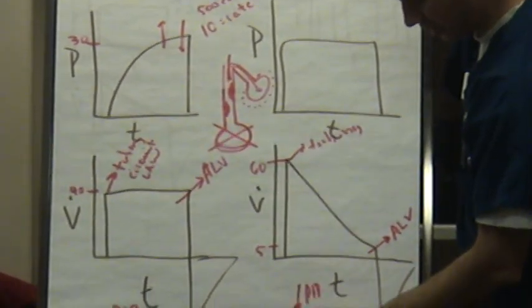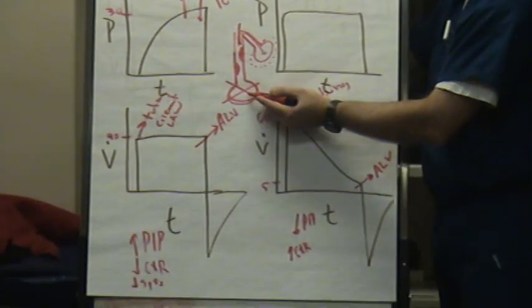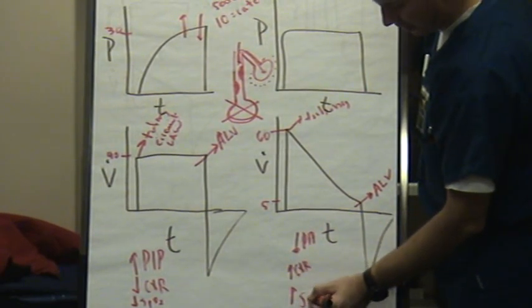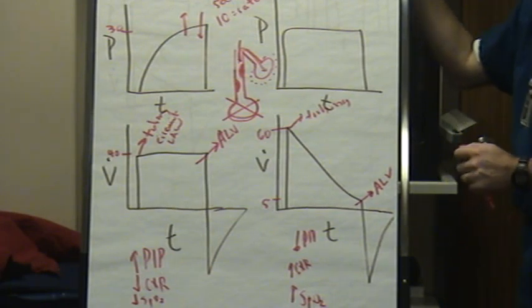And you'll see this 9 times out of 10. You'll see it within the first 3 or 4 minutes. What's their SAT going to do if this begins to occur? It's going to go up. And you've touched nothing except the mode. You haven't touched FiO2. You haven't touched anything else, PEEP or anything. You just changed the mode. So an increase in saturation will occur.